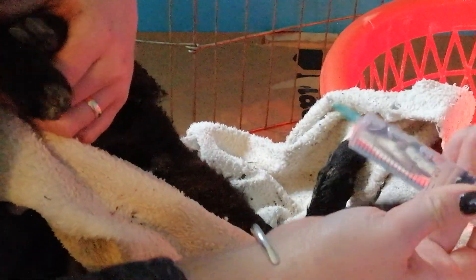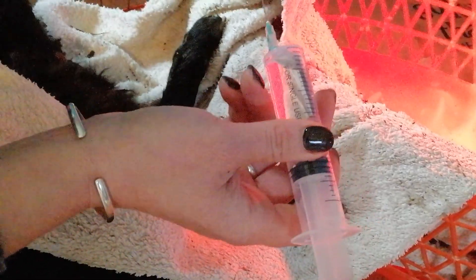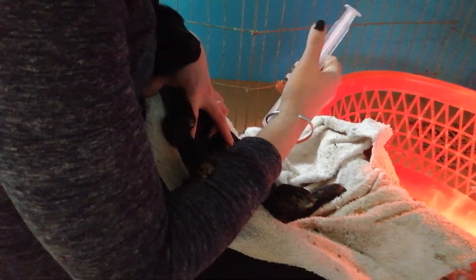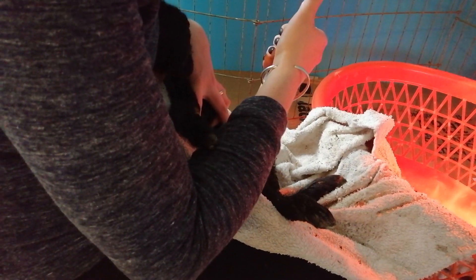This is a 25 mil, 20% dextrose injection with a 21 gauge hypodermic needle. The way we do this is about an inch below the belly button and about an inch to the right or left, pointing towards the tail head.